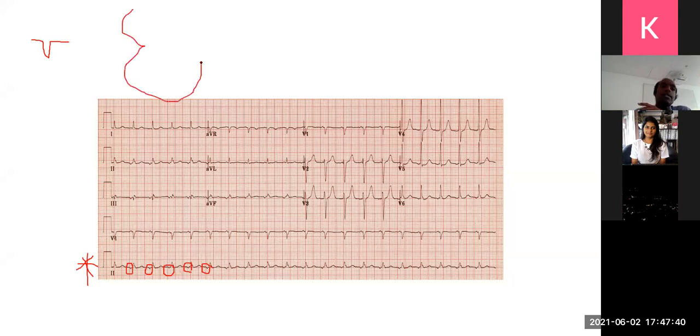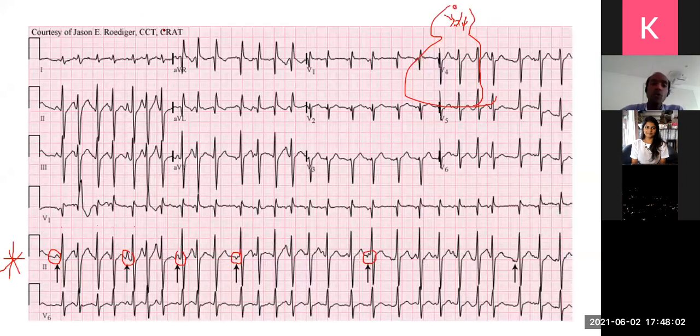Here what is happening is, say this is the sinus node. There is the atrium and the current coming again. So the sinus node is suppressed. The atrium is running the show with this current coming from another place. So this is called unifocal atrial tachycardia. So unifocal is from one place, multifocal is where it starts firing from multiple places.